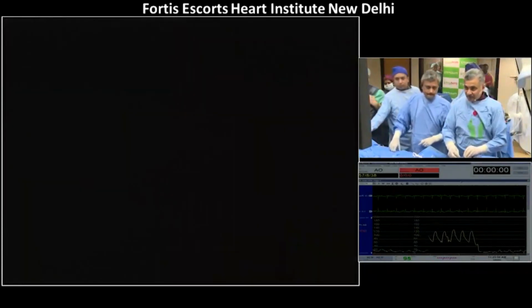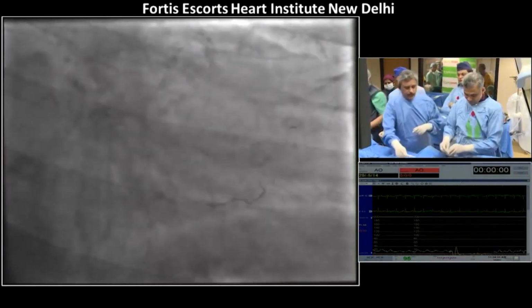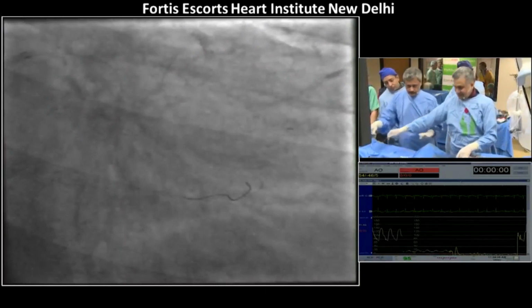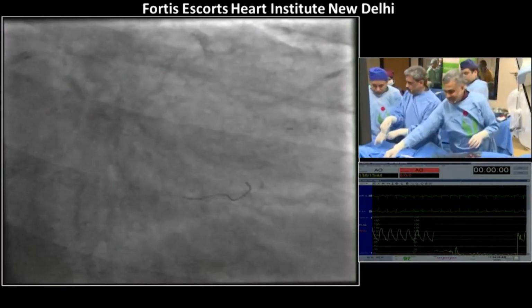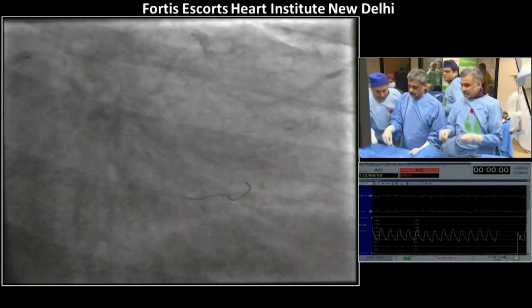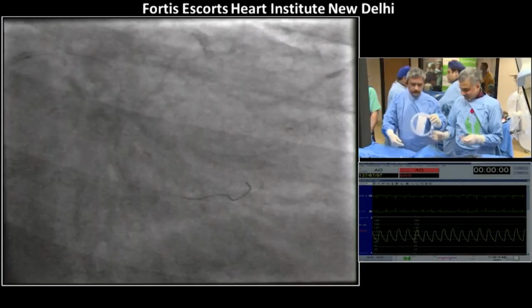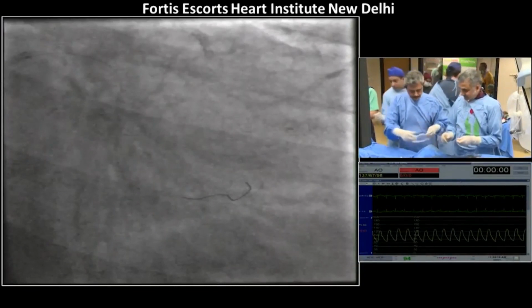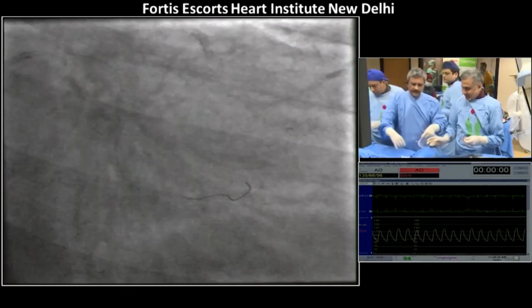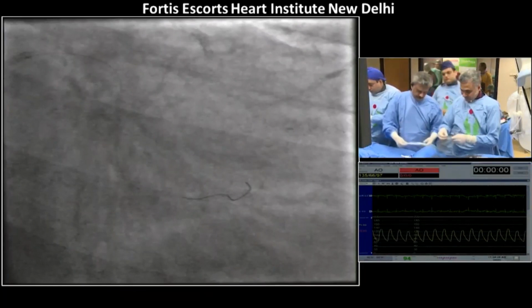Anybody in favor of a cutting balloon? There is significant fibrosis, but it is outside the stent. You just implanted the stent, so I think you should be okay. You can use a cutting balloon, but I don't think you need to at this point. You want to stay well away from the edges, but you're going to re-stent the outflow anyway, so make sure you get the stent down and expand the prior stent. We have to be careful not to have a rupture. That's the most important thing.